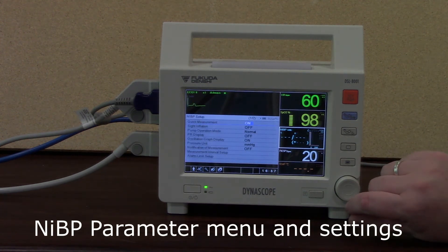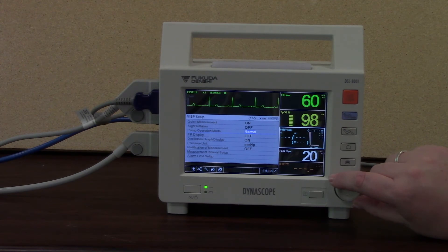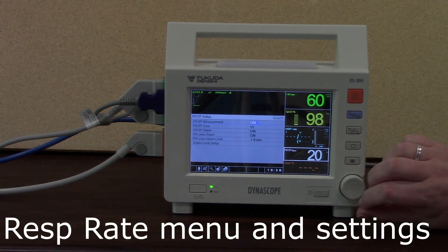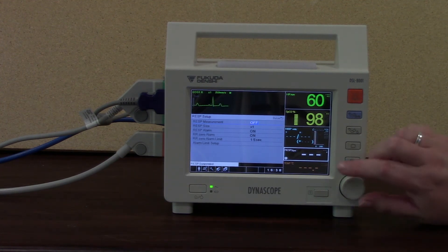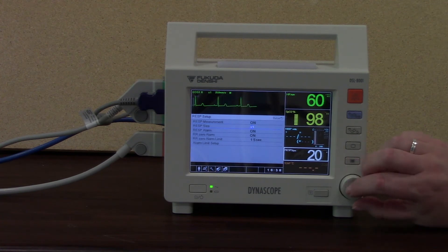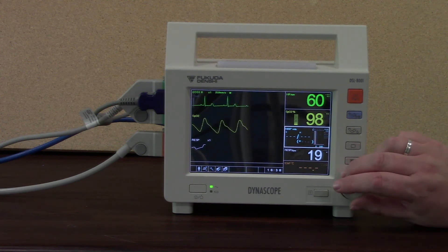Looking at the NIBP parameter menu, picking out some of the main things you might want to use — alarm limit setup is at the bottom. For respiration setup, I can choose to have it on or off. If I choose to take it off, it won't measure my respiration rate any longer. I can also choose the size of my waveform as with ECG, and choose whether I want the alarm on or off. Those are the main things you can see with your parameters.